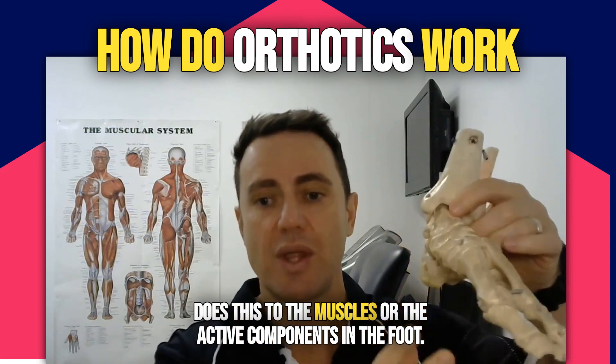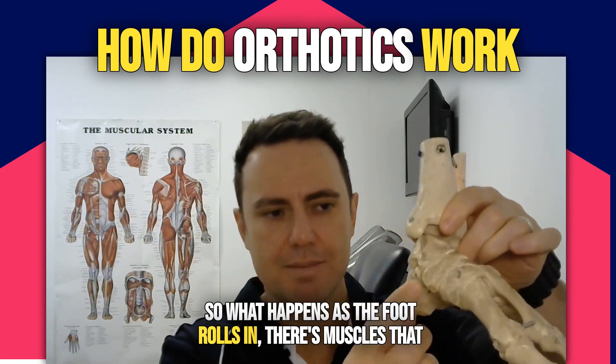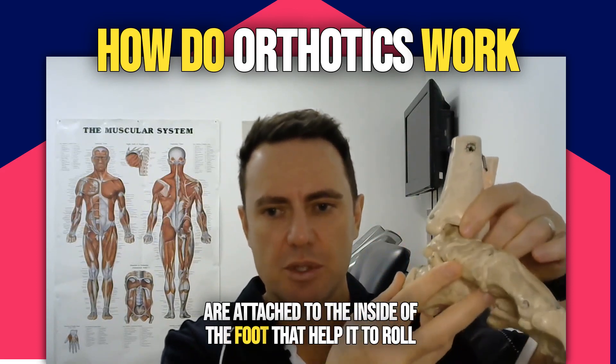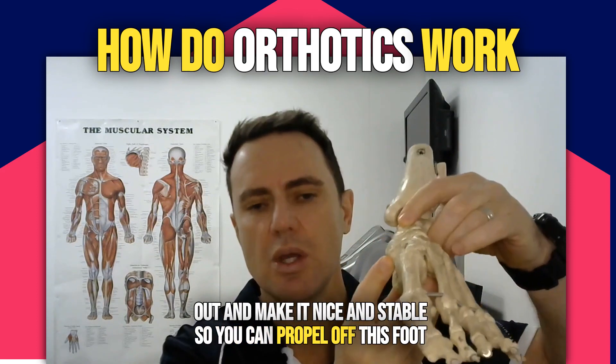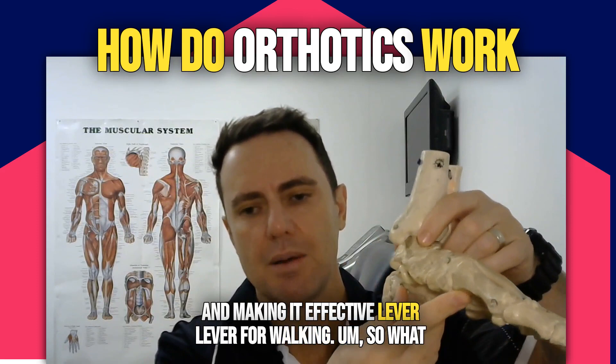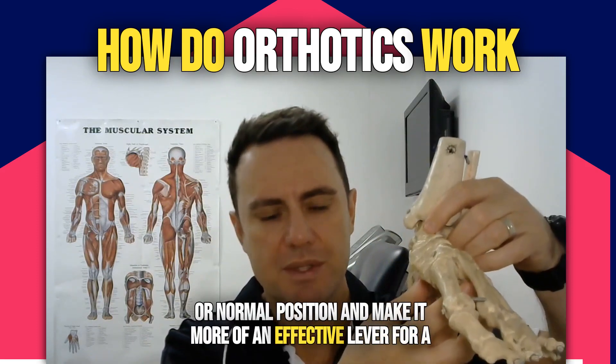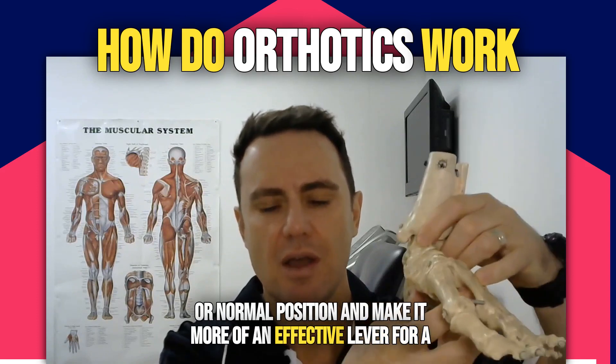It also does this to the muscles, or the active components in the foot. As the foot rolls in, there are muscles that attach to the inside of the foot that help it to roll out and keep it stable, so you can propel off this foot and make it an effective lever for walking. What an orthotic does is help to keep the foot in a more neutral or normal position and make it more of an effective lever for propulsion.